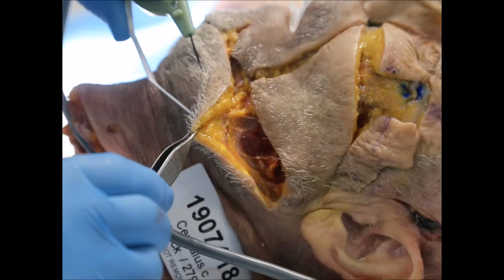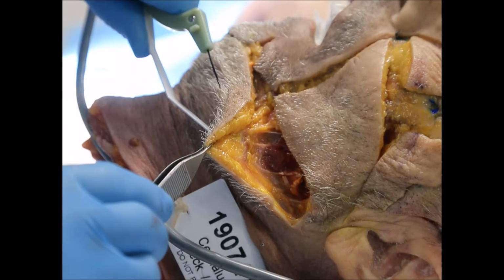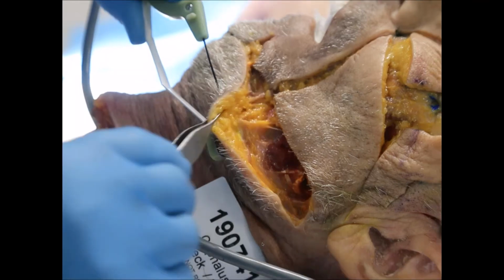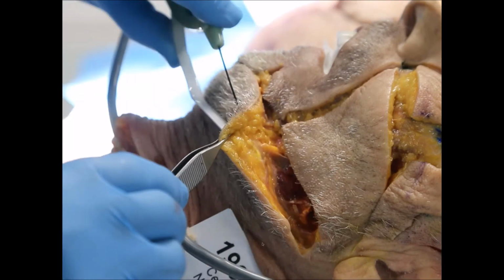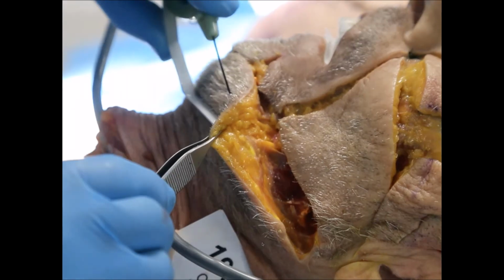But I show you with the AccuTite in the cadaver. Hope to see you not very slow. You can see that I'm doing very low fat, and I'm passing with my cannula. If you hear the sound of the AccuTite, I'm treating, but you cannot see anything on this fat. So I'm treating all among the two electrodes. So I'm more superficial. This is the first thing that you must know.